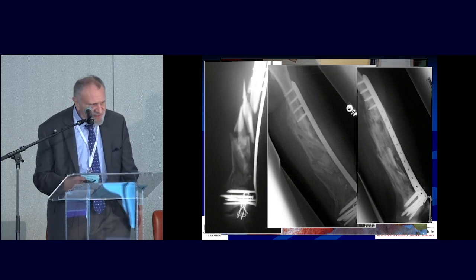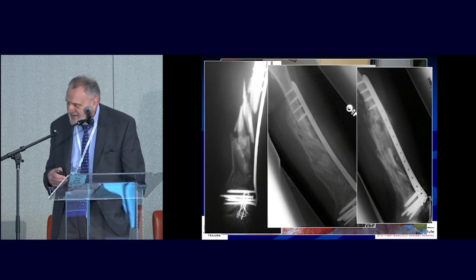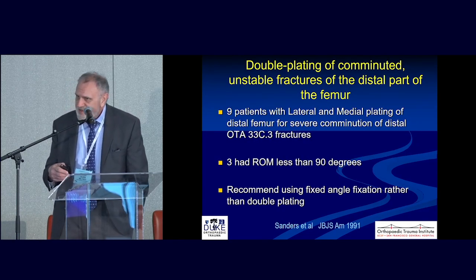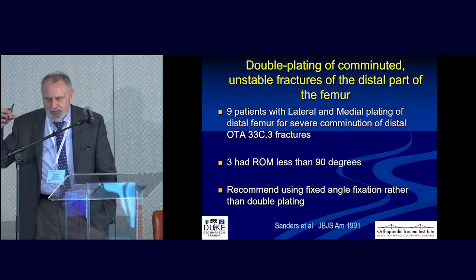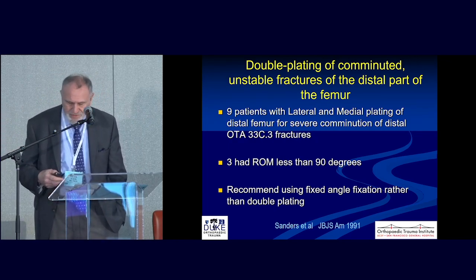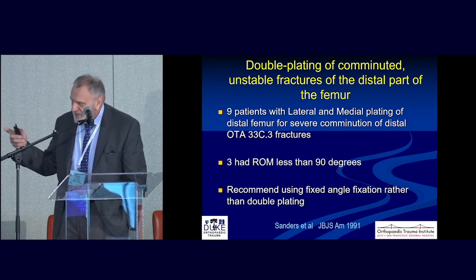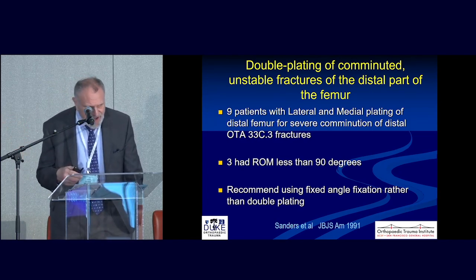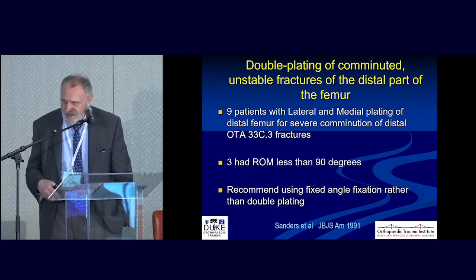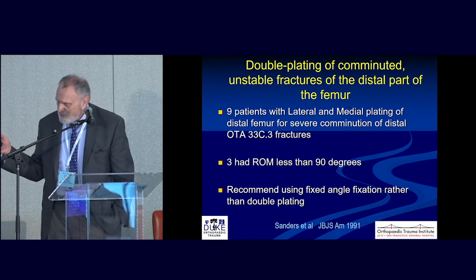So that's one of those things that just works. It's an interesting, exciting concept that we all take advantage of. And I think one of the reasons this became so popular, that a lot of our younger surgeons don't appreciate, but Tim and Andy and Kyle will, is this paper from 1991 from Sanders and Kwiatkowski, where they were having trouble with a standard distal femoral plating, and the problem was that it kept dropping into varus, and so they went with double plating.